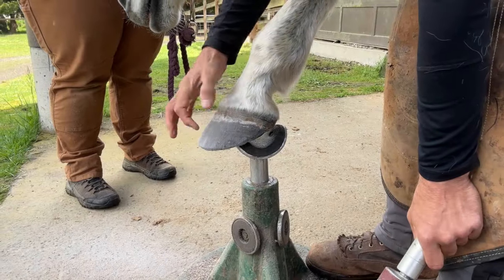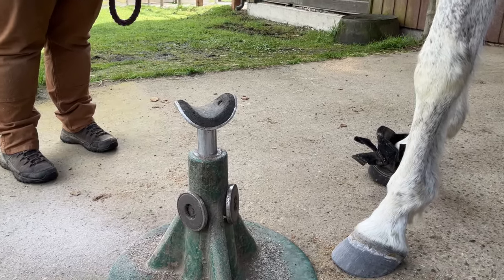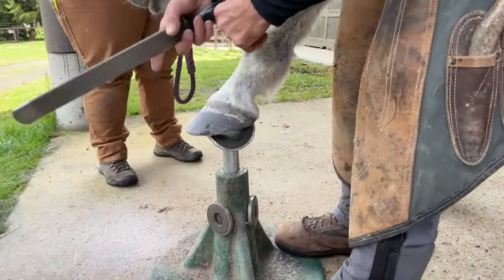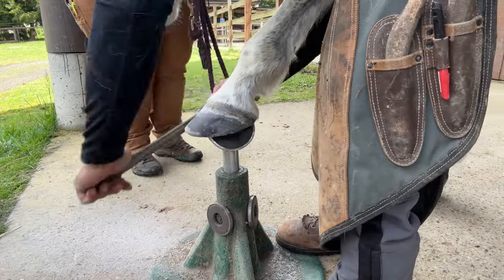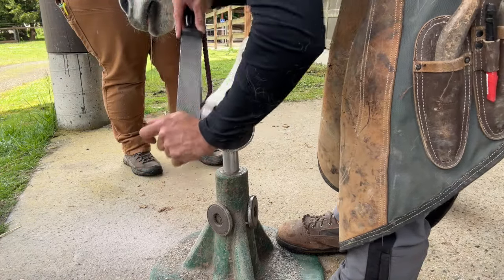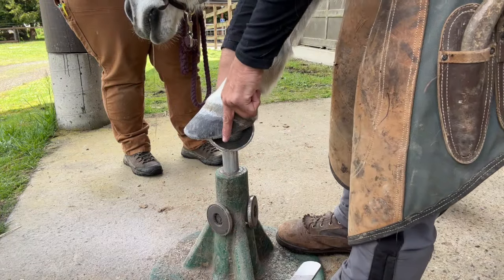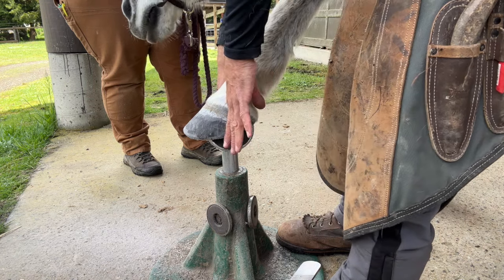So, having a clean surface for your glue and/or cast. You don't have to use this; you could use your rasp. That looks like literally filing it pretty smooth. Like so, but then taking the edge of your rasp and scoring it, where you've got now a bunch of little fissures for your glue to stick into. And I typically don't worry about from my widest part back, because that's what we don't want to restrict.